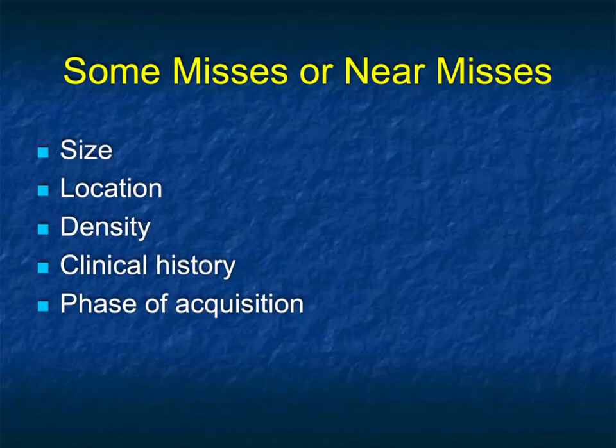Clinical history. Obviously, we talk about diabetes, we talk about weight loss. Diabetes is something that is being looked at very, very carefully, particularly in 50 and 60-year-olds. And the quality of the scan. If I ask you for a pancreatic protocol, you're doing arterial and venous and thin section, and so you're more likely to see the tumor. If you're just doing a run-of-the-mill pancreas as part of an abdominal CT where you're doing 3 to 5 millimeters, you may miss it. Also, you have no suspicion.